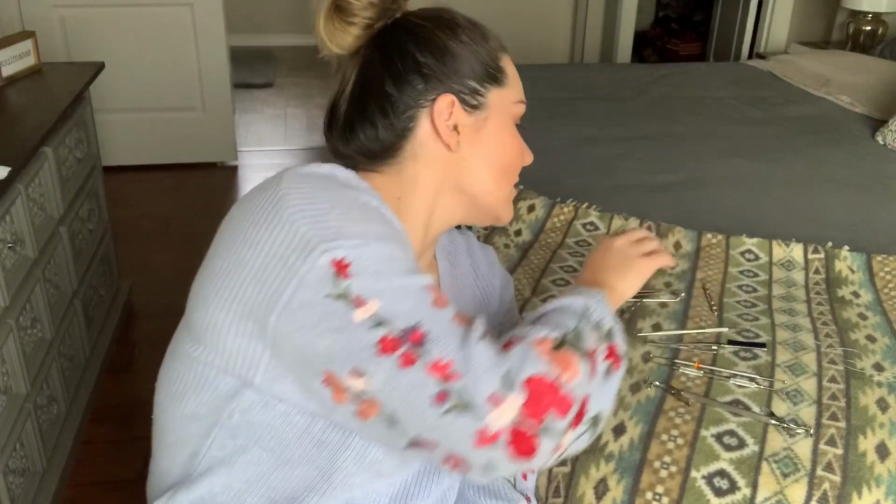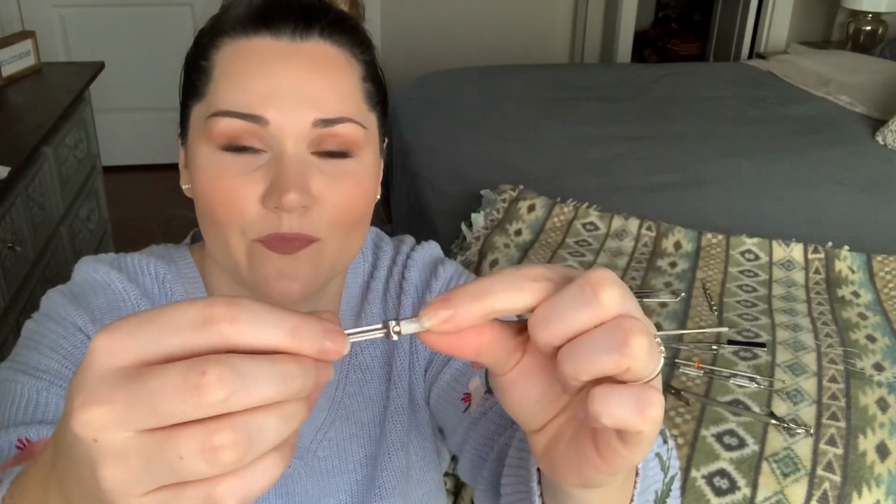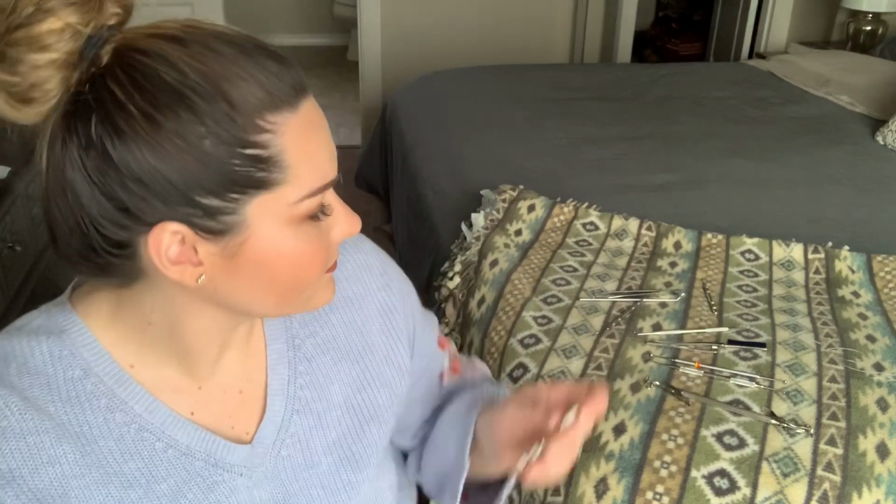All right, so yes, this is the first thing you're gonna hand the dentist. So you hand it again, handle first. You don't wanna hand it this way. You wanna hand it with the handle, because that's what they're gonna be grabbing. He's gonna place it, and then he's probably gonna ask for a wedge, which my office uses little wooden wedges, which I don't really have, but you want to hand him a wedge.